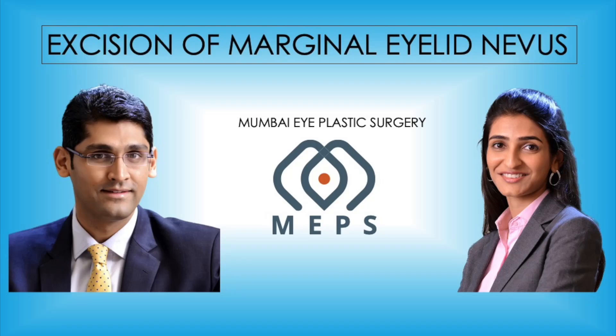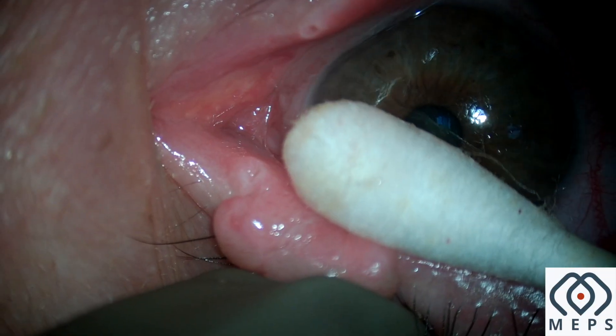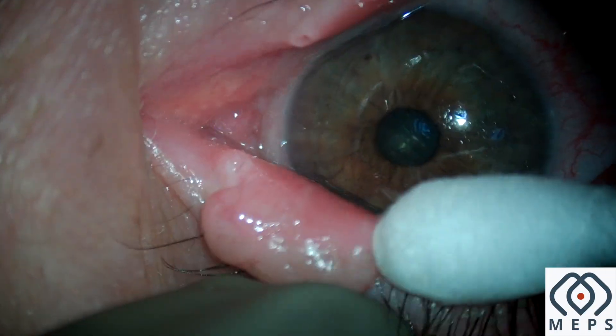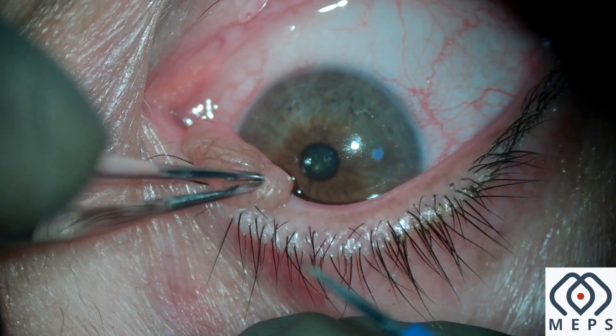Excision of a marginal eyelid nevus in 4K. Before surgery, we infiltrate the surrounding eyelid at the base of the lesion with 1 cc of local anesthesia.